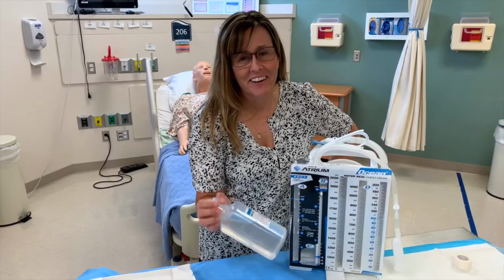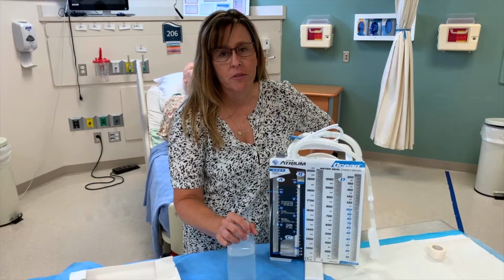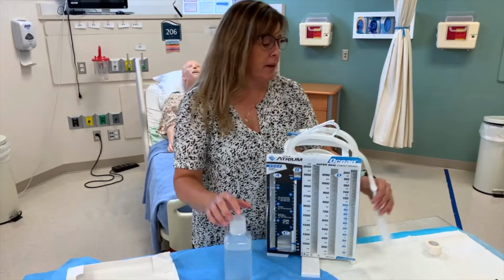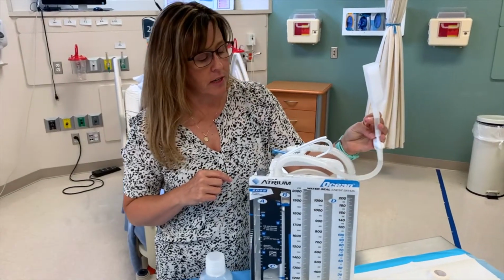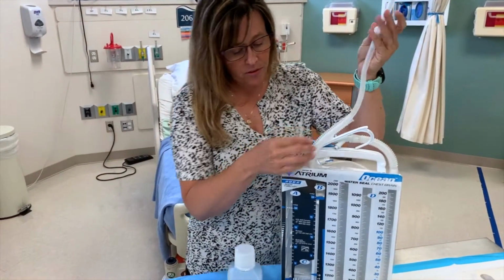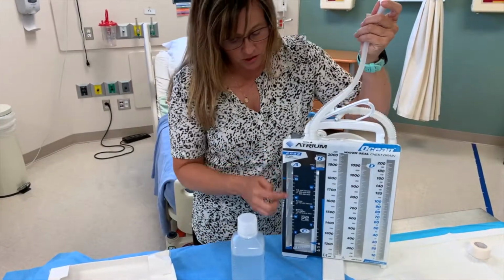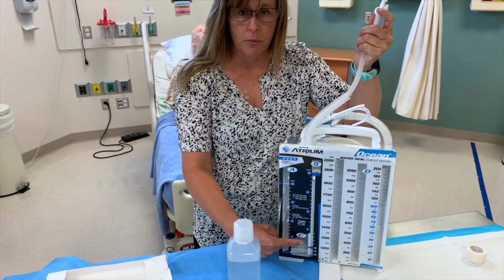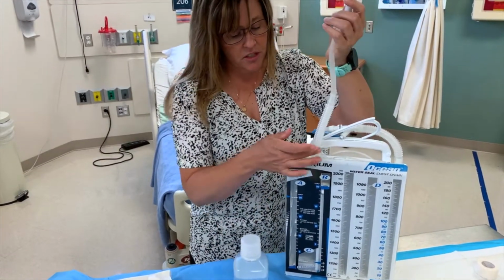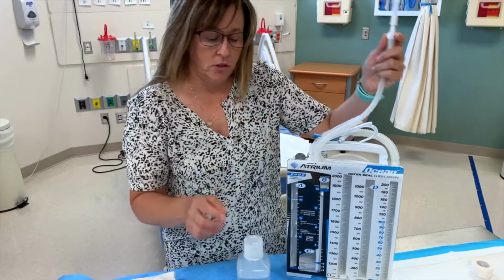Okay, guys, now we're going to fill our actual chest tube container with our sterile water. There will be a tube here that's connected that has our filter and our funnel. This funnel is what's going to help us fill both of our chambers. We're going to be filling our suction control chamber and our WaterSeal chamber. It's connected to the WaterSeal chamber, so we're going to do that one first.